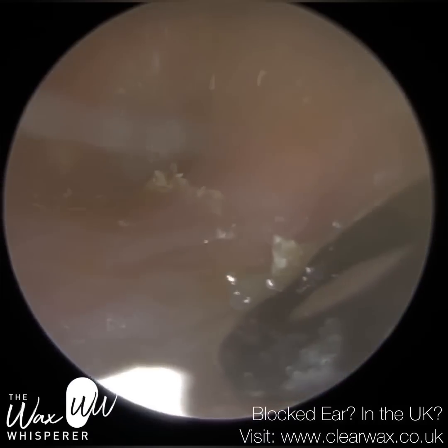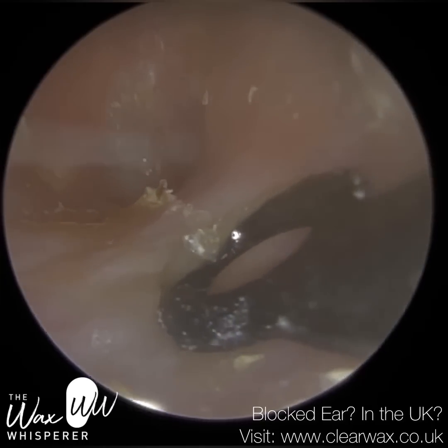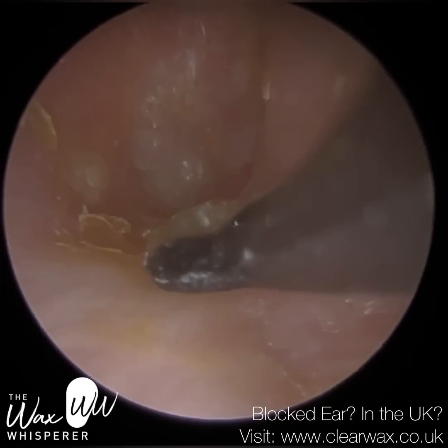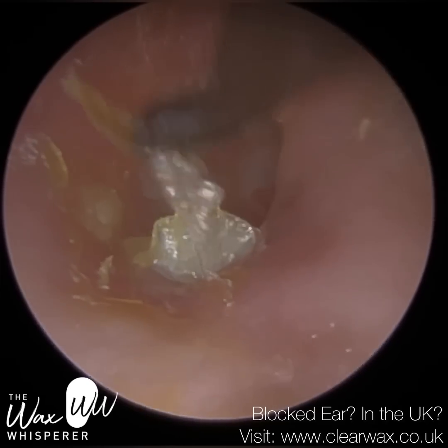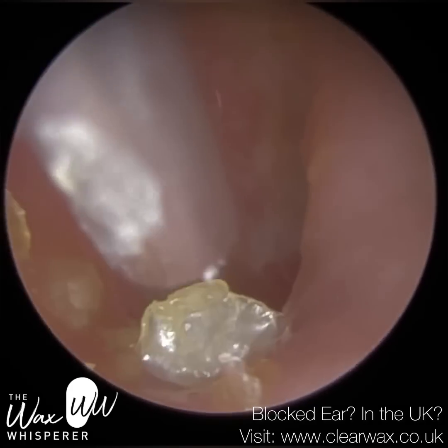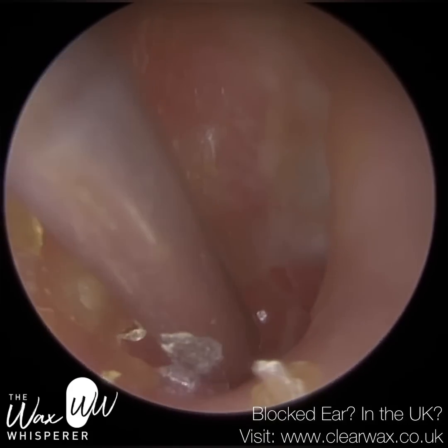You've seen there that I was applying a lot of pressure upwards, and the Curette just came over the top of the skin, and you don't want to let that Curette then flail around in the ear canal. So you've got to have full control, just like that. You've got to be prepared for when the Curette is no longer underneath the skin, because that force, that pressure you're applying, then means that when the Curette leverages over the dead skin, there's no support, and it can just flail in the ear, and it can hit the delicate structures. So you can see that's just helped lift this skin at the bottom as well.